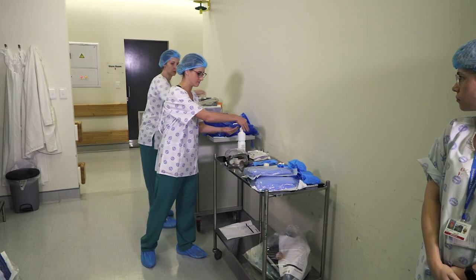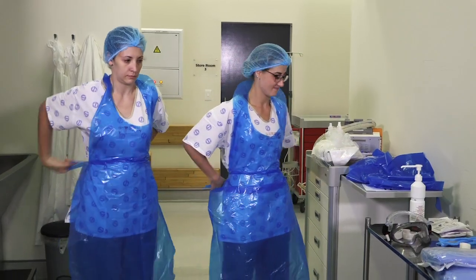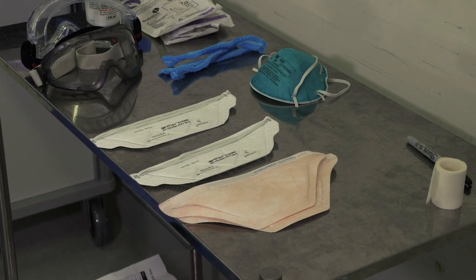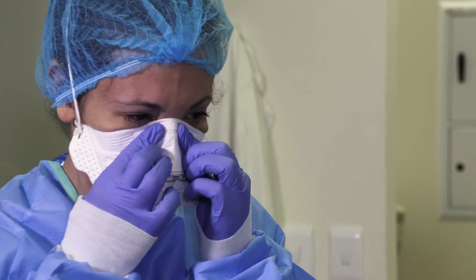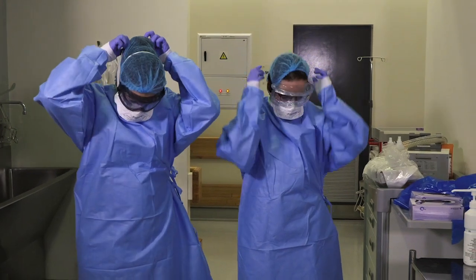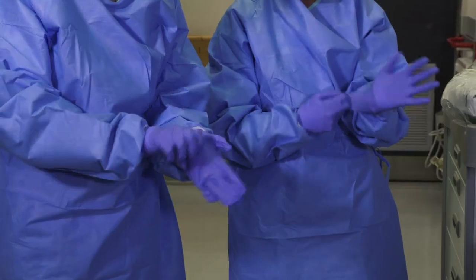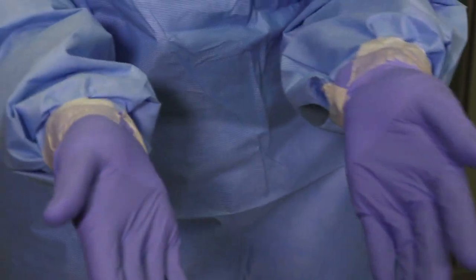Hot one and hot two, please don your PPE. Wash your hands, then gloves. Please put on your N95 masks — our team have pre-fitted their masks, they know which size and which make suits them. Check for leaks. You can now put on your eye protection. And you can put on your outer gloves. Lauren, please tape their gloves to their sleeves. The tape means that when you remove your gown, your outer gloves come with it more easily.